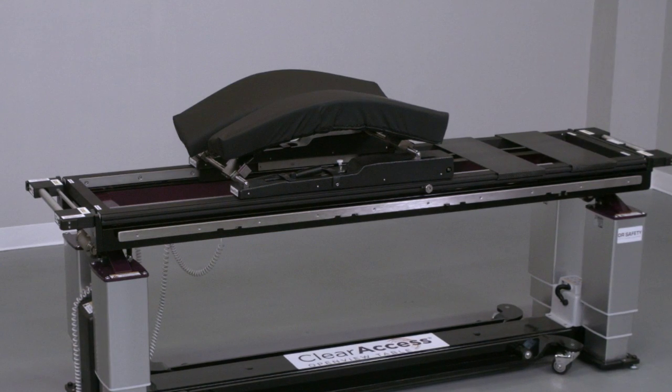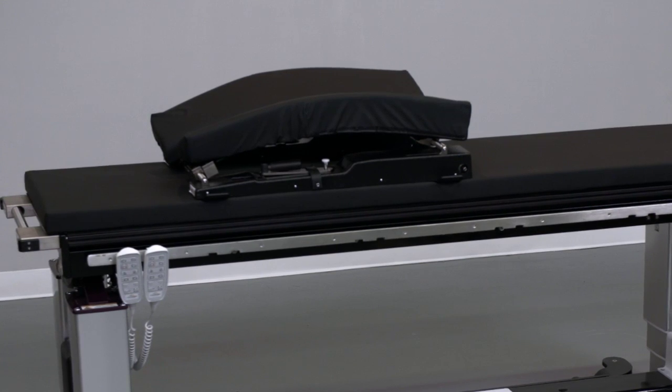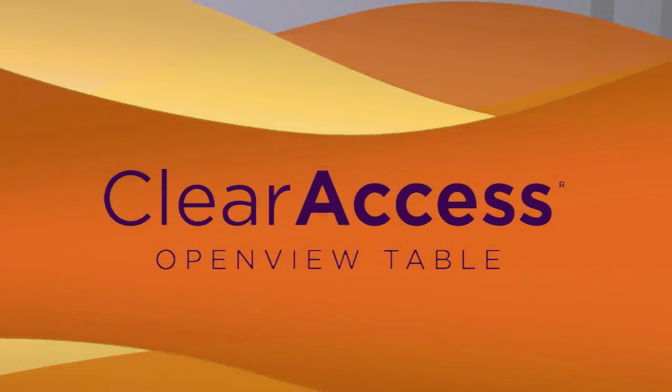There are two versions of the FlexFrame: the standalone version that can be mounted on any suitable flat-top operating table, and the Clear Access version that can be used only on the prone platform of the Clear Access table.